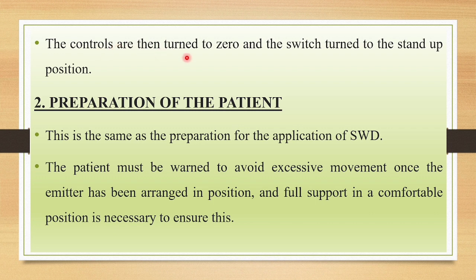The controls are then turned to 0 and the switch turned to standby position. So after checking that the apparatus is working, the output switches are turned back to 0 and kept in the normal position, ready for the treatment of the patient.